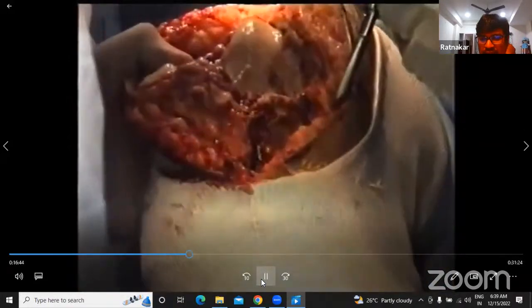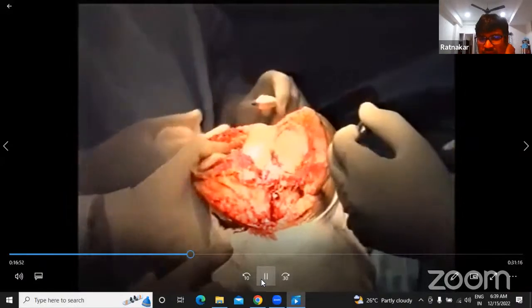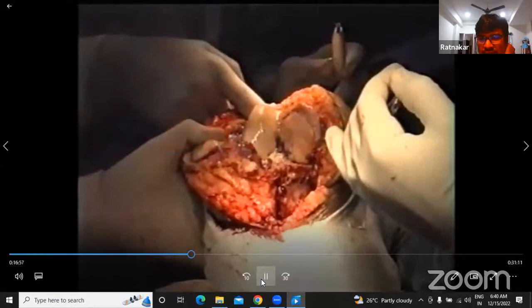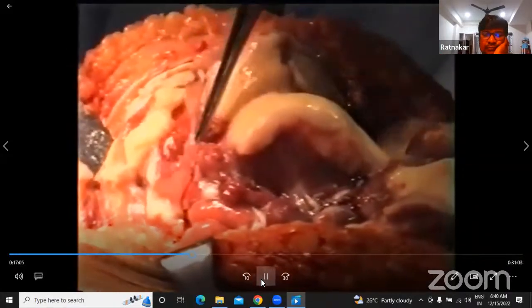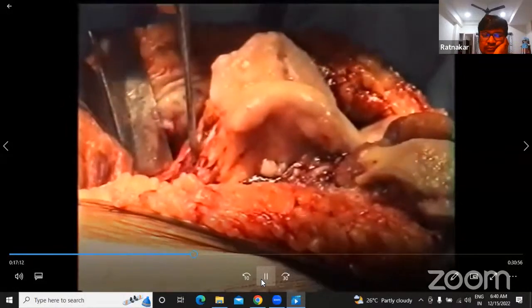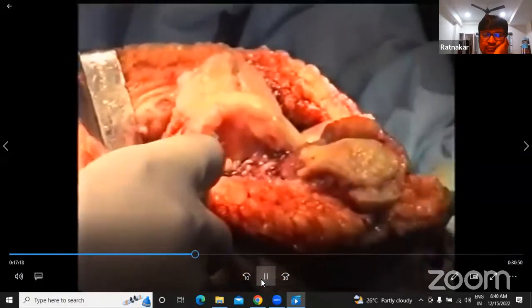Now you've got to externally rotate the leg and gently bend the knee to 90 degrees. Do not struggle. If the patella is tight, then you have to do some more dissection. Hypopatellar area, this is the femoral condyle. This dirty synovium needs to be taken off. But some people feel that you should minimally violate the suprapatellar pouch. And that is the supracondylar area of the femur, which is useful for our referencing in the future. You can see all this osteophytosis in the femur, including the patella here. First of all, we'll do osteophytectomy.